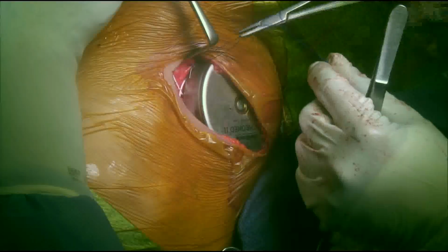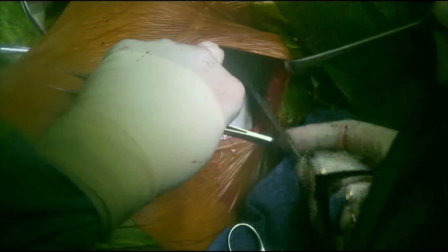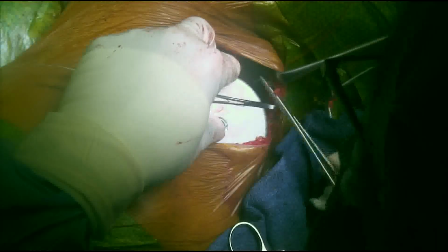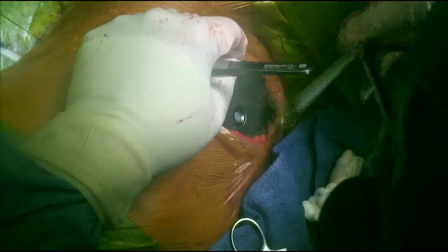Moreover, it would be helpful for you to remain updated with the most recent guidelines, such as the NICE guidelines, and also to consult with the product manufacturer and the company representative regarding the suggested indications and contraindications from their side, as these can sometimes change over time. The current indications do not support implanting a baclofen pump in children under 4 years of age.